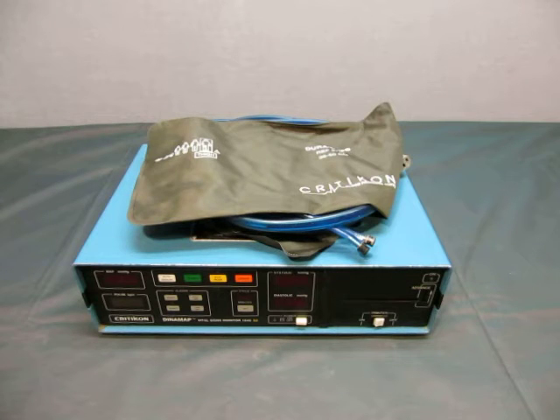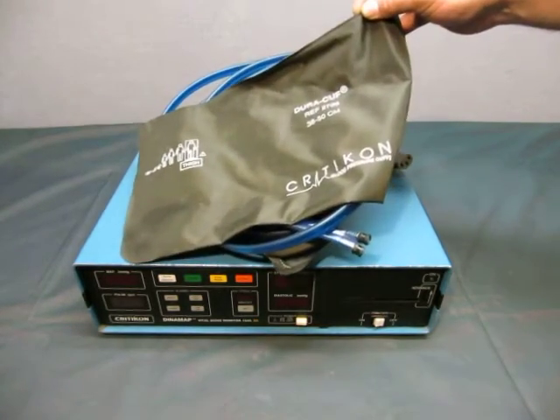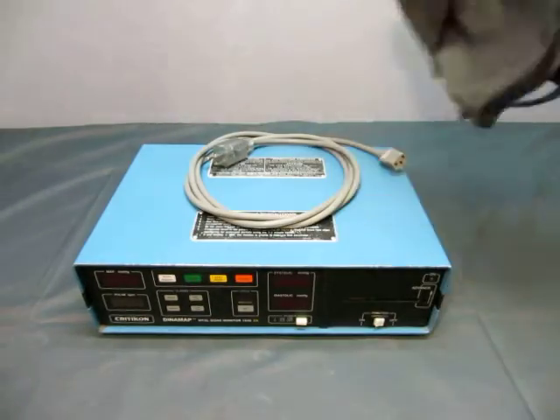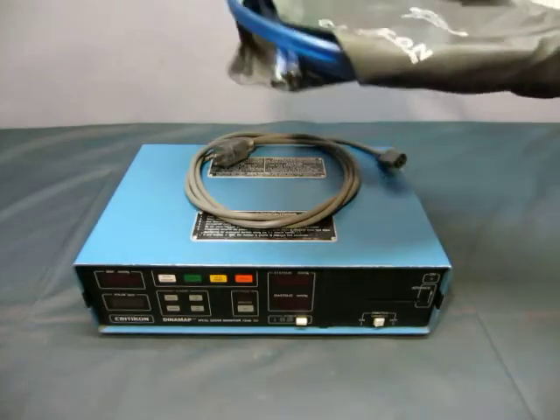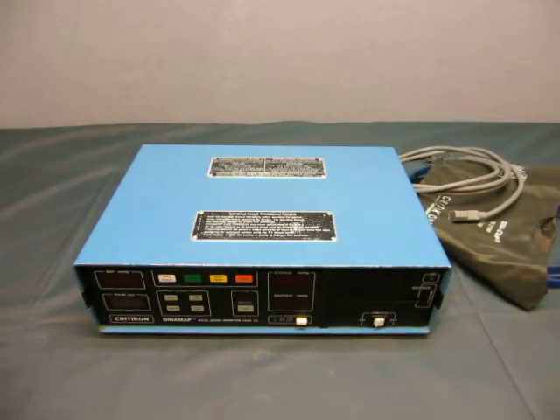Up for auction we have a DynaMap Criticon Vital Signs Monitor 1846SX with a Dura Cuff, 38-50cm for a thigh. That's very interesting, and it's got some wires there and a power cord.